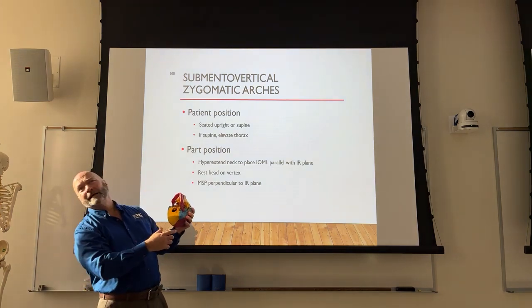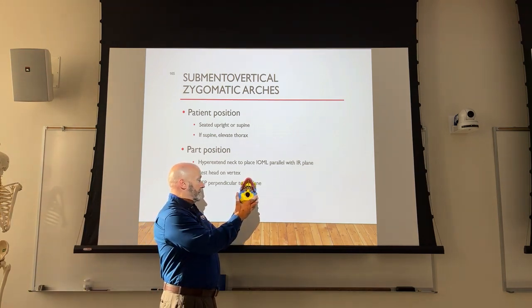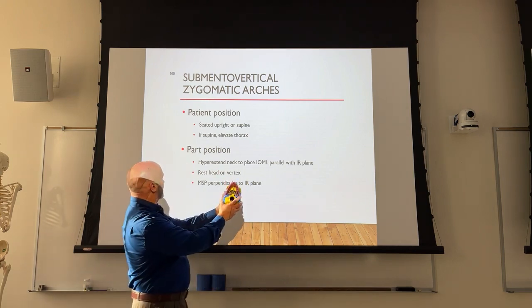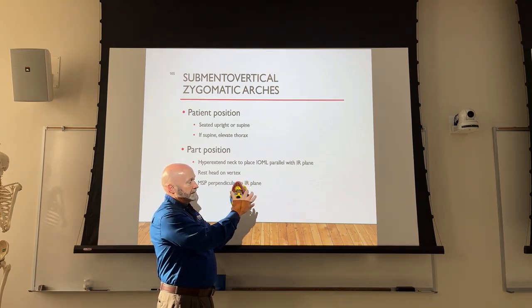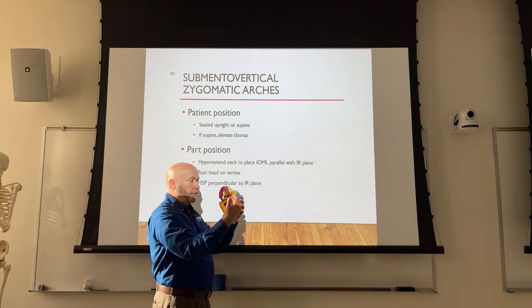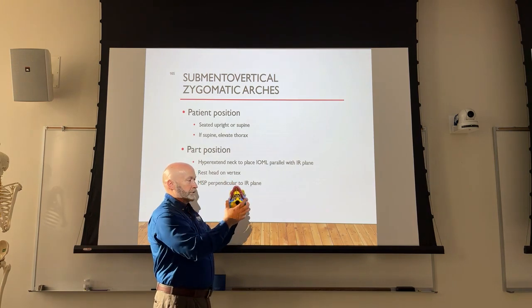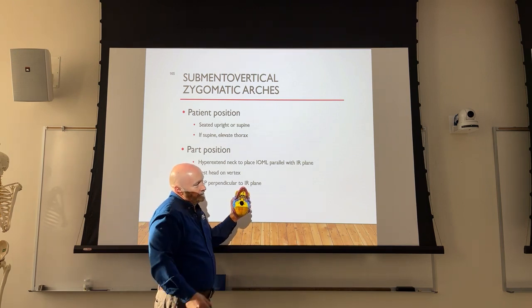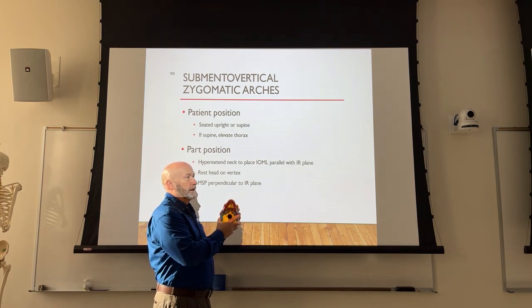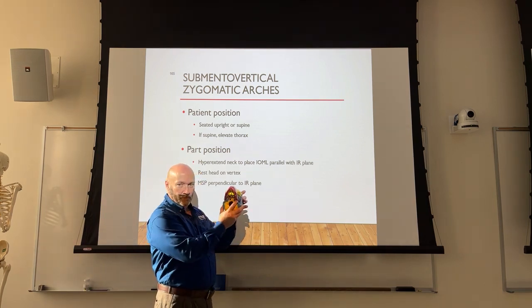Well, here we've got about a 10-foot SID, which means that here in the middle of this screen, there's not a whole lot of divergence, right? But the more divergence you can take advantage of, the more it will project these zygomatic arches, since they're further away from the image receptor than the widest portion of the skull. They'll be more prone to projection away from, or misprojection, than what's closest to the image receptor.